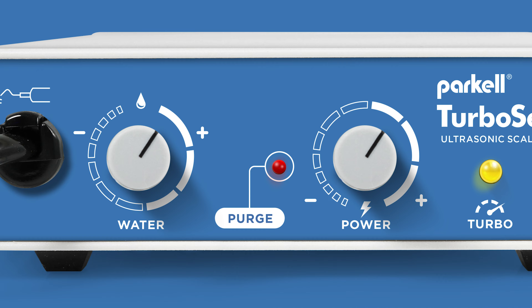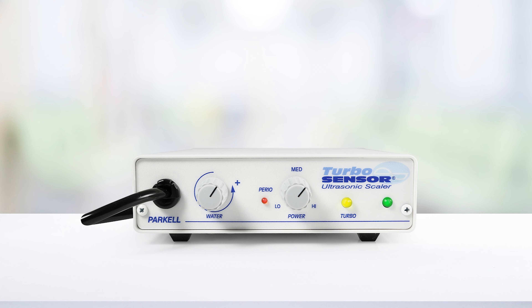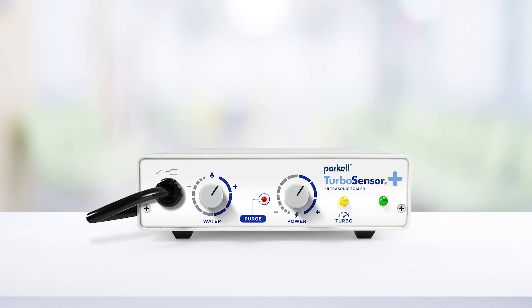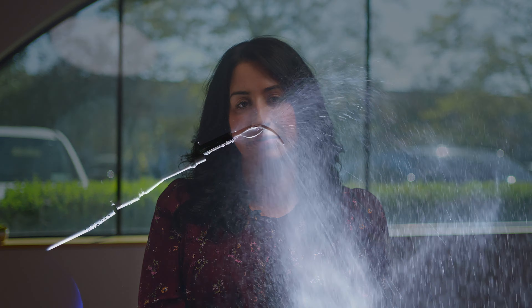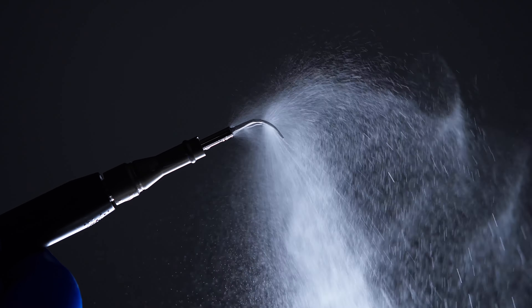TurboSensor Plus — where legacy and innovation meet. The TurboSensor Plus ultrasonic scaler combines the reliability and performance of its trusted predecessor, the TurboSensor, with exciting new features that enhance the scaling experience in today's demanding work environment. Built around a new IntelliSense processor, the TurboSensor Plus ensures top-level consistent performance with all market-leading 30k inserts.